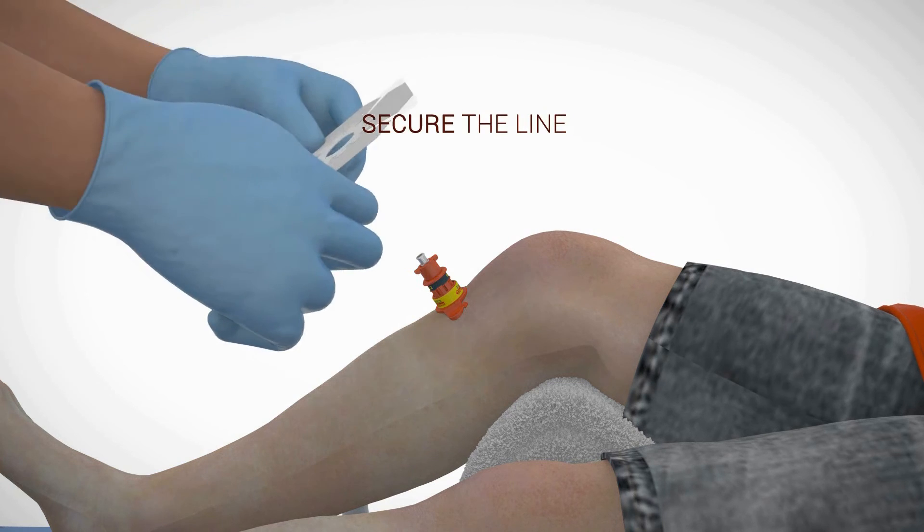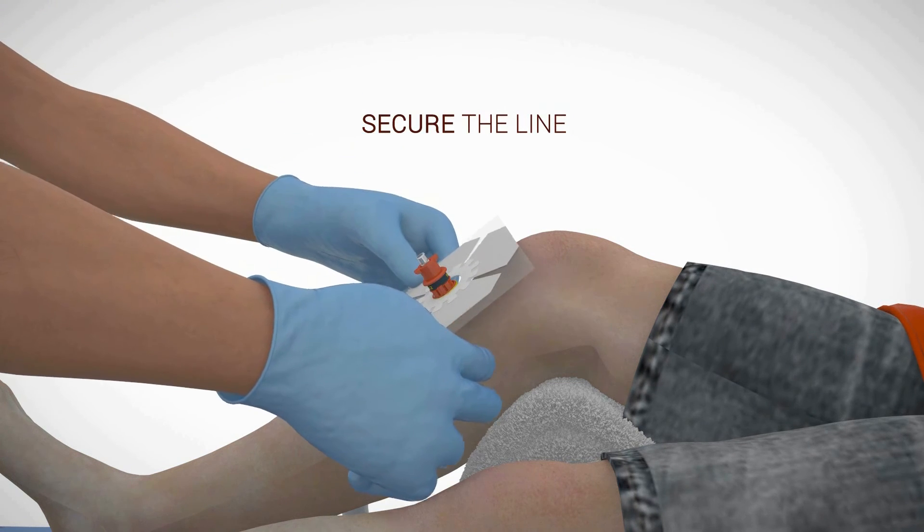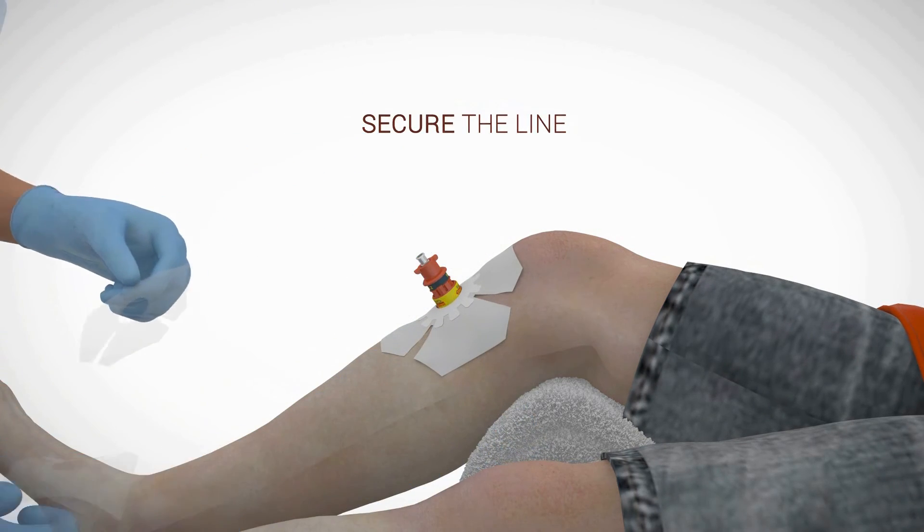It is recommended to use the NeoFixation to affix the needle stabilizer to the skin and fully secure the I.O. line.